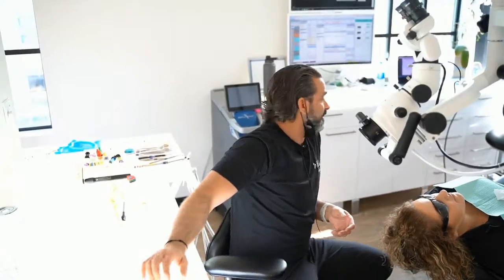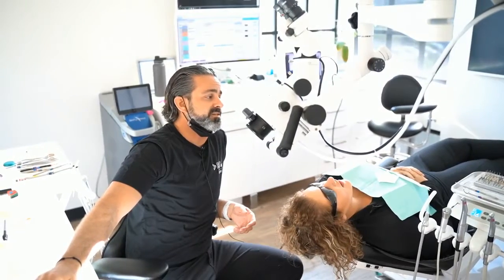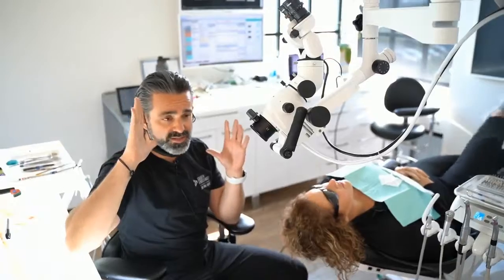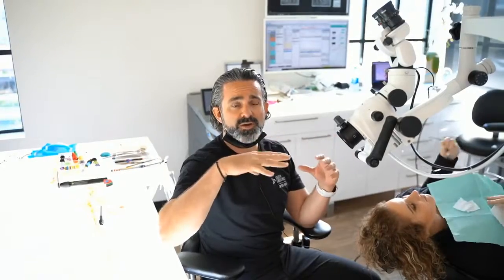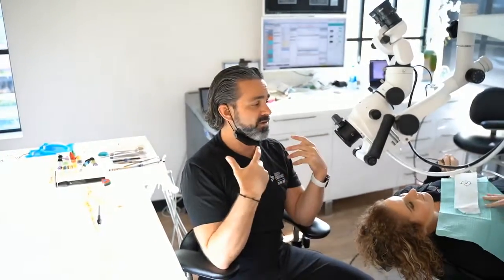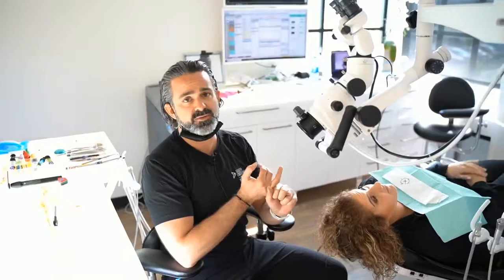Good questions. Okay. I'm trying to think if I've missed everything. We've talked about position mounts. Number one, I think the most important mind frame is to look at your room, figure out your ergonomics, and where you want your microscope mounted. You're going to think about how you and your patients walk in and out of a room, and then about vibration.